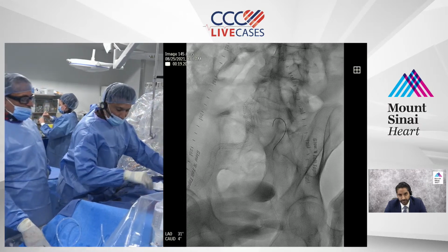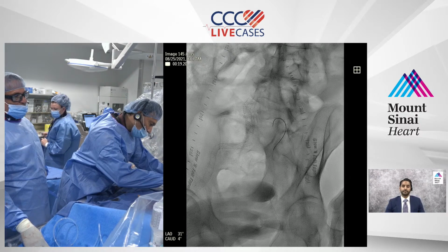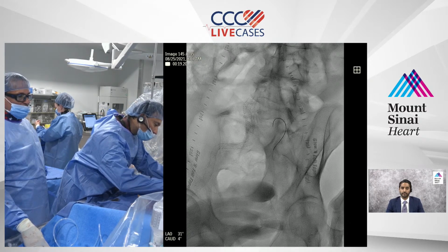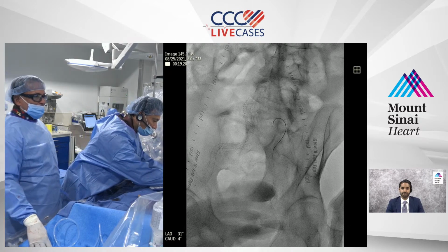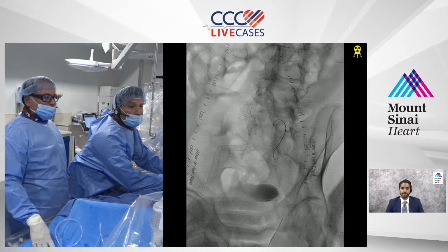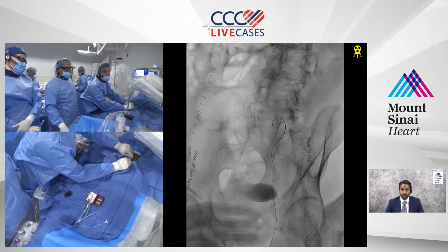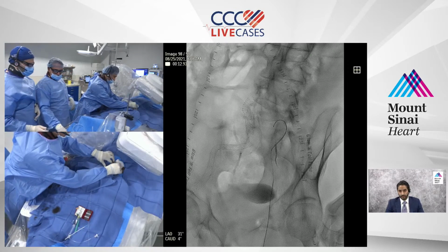So the idea here would be, do we get dual access? Do we not get dual access? How do we do it? I open it up to Karthik and you to see what you think on how you would approach this. But our plan here is to really get an understanding of the best way to preserve the up and over option versus having to stent both iliacs. So that's kind of where we are right now. So let's take a picture.